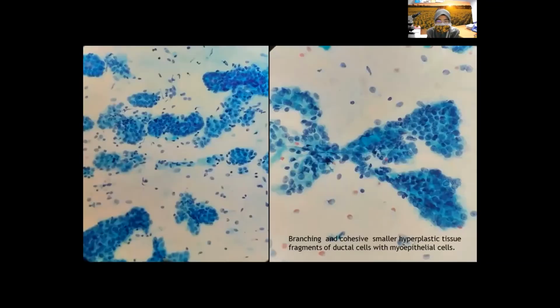So these are the air dried, alcohol fixed smears. The other views show groups of cells that are tightly cohesive, with presence of myoepithelial cells. Some groups show branching hyperplastic fragments of ductal cells.